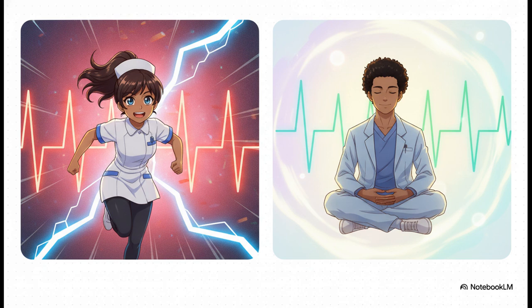In sinus tachycardia, the heart is racing, right? So the R to R interval is decreased, meaning the spikes are crammed really close together. In sinus bradycardia, the heart is beating way too slowly, so that R to R interval is massively increased. The spikes are spread super far apart.